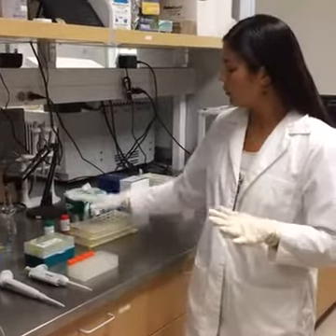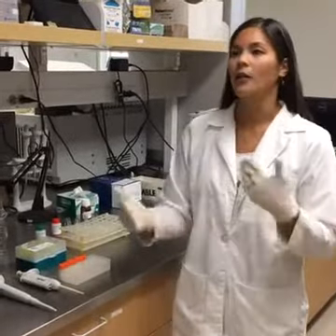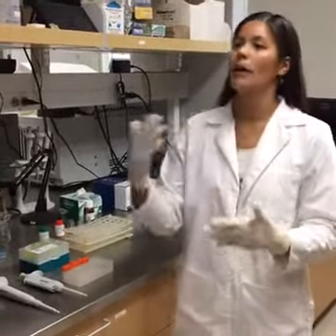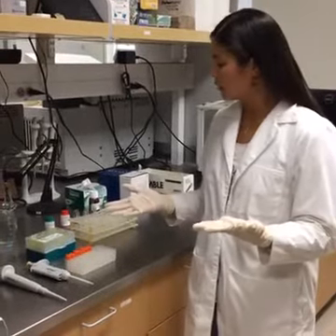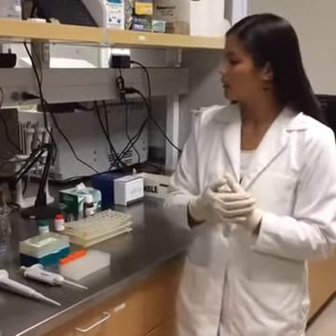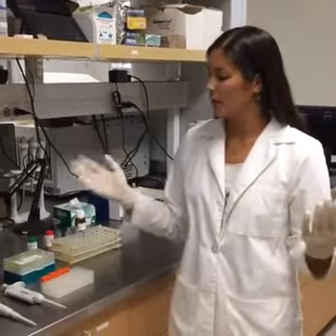Once the reaction occurs, we measure what's in the tube. From that, we can get a concentration of how much cortisol, or thyroid hormone, or whatever I'm measuring, is actually present in that blood sample. So we're able to get concentrations of all these different markers. We do RIAs, which is what the setup is here, and there are ELISAs, a lot of different ways to accomplish this with proteins, antibodies or enzymes. Those are all different assays for different markers.